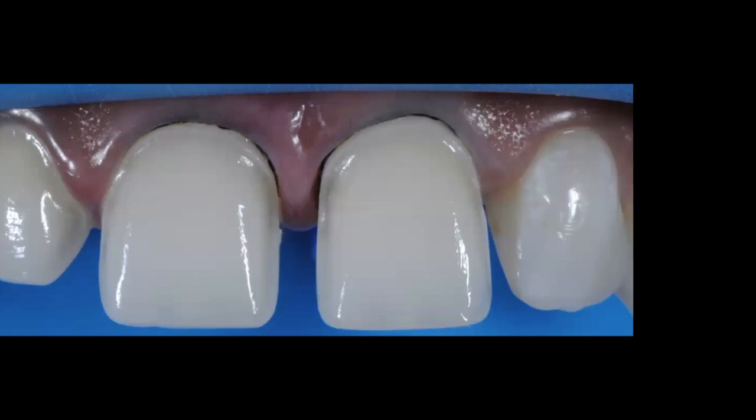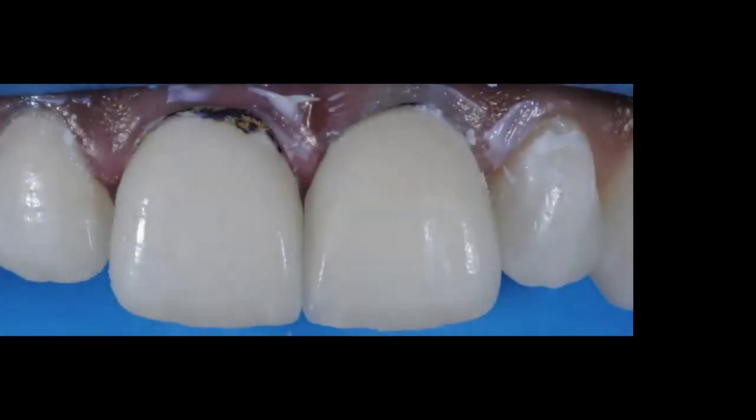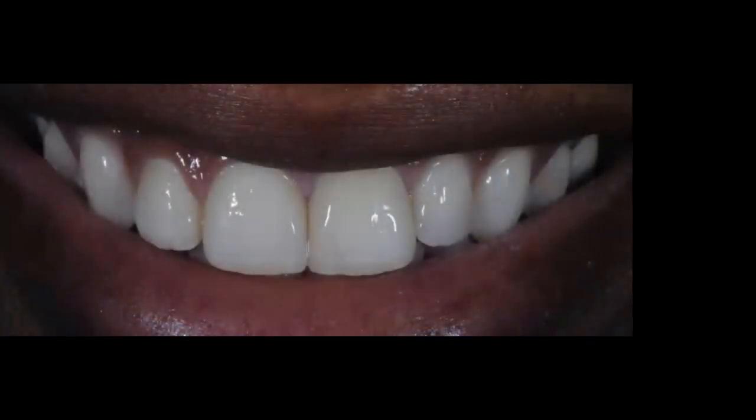I prefer light-curing the adhesive before bonding the veneers. For this to work without issues, make sure there is no pooling of adhesive on the preparations before light-curing. Here you can see all three veneers — 7, 8, and 9 — fully seated. I've removed the excess and will now remove the cords and get to my final restoration.